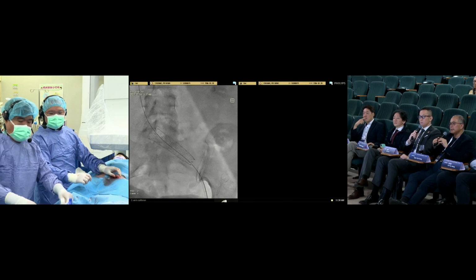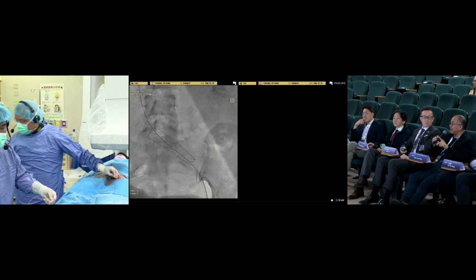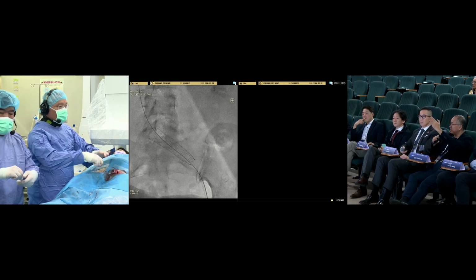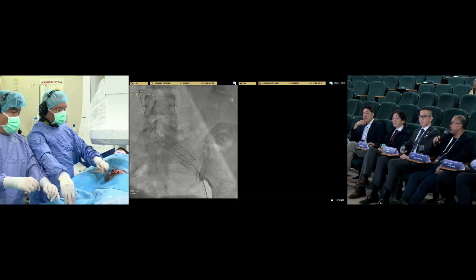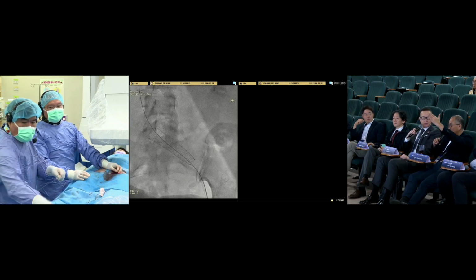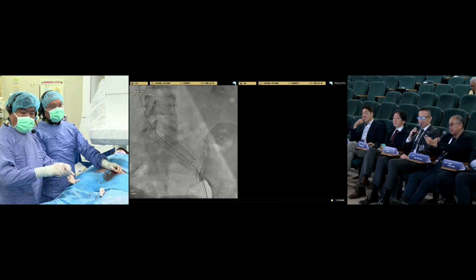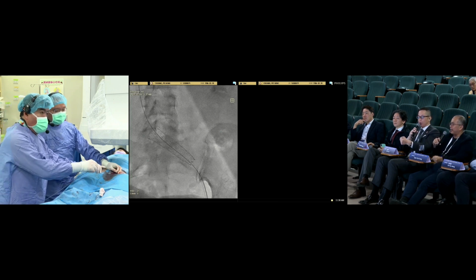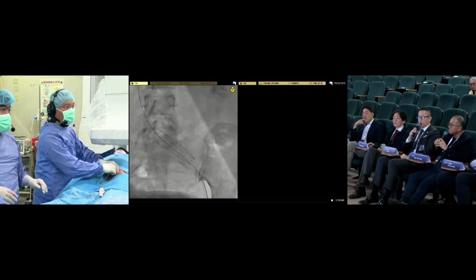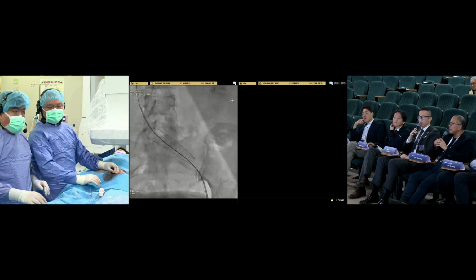Can I just ask, do you feel that's a long enough stent for the lesion? Would you leave it like that, or would you take the stent lower down into the straight portion because of the risk of it pushing up? It's a very short stent. Is there any thought about extending that stent into what we call the black zone, basically straight down? Otherwise, there's the risk of it pushing up, and always hold off the balloon during post-dilate. And for a longer stent, I prefer to do the distal ballooning to anchor the stent first, to avoid migration.